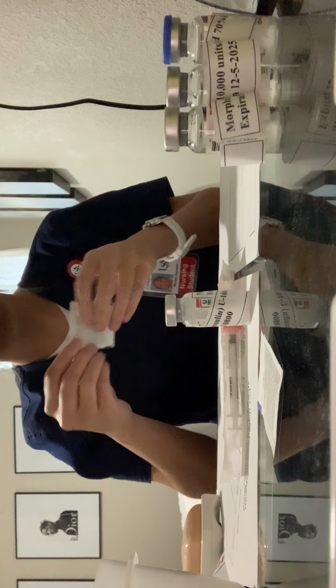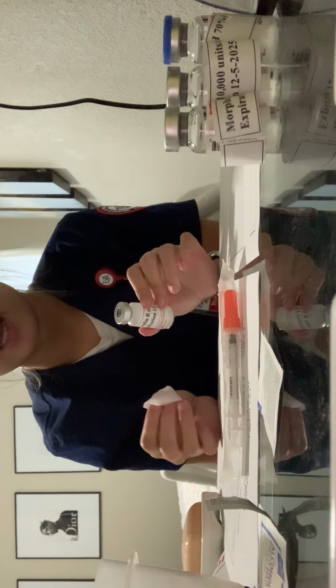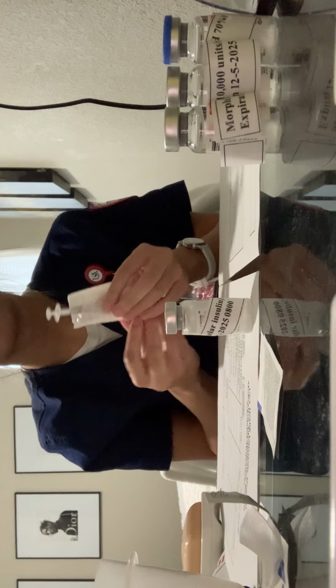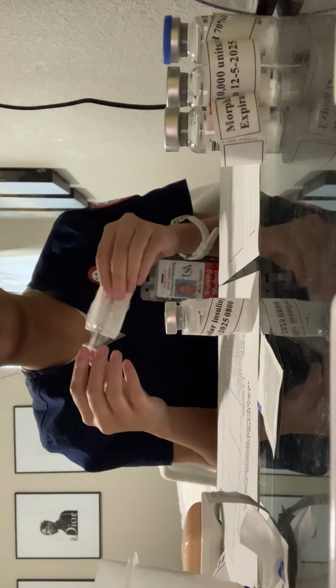So I'm going to prepare my medication, get my alcohol prep pad, and I'm going to be wiping the top of my vial, and I'm doing circular motions outwards like that. And I'm going to be getting my syringe out. I still have to be sterile later.